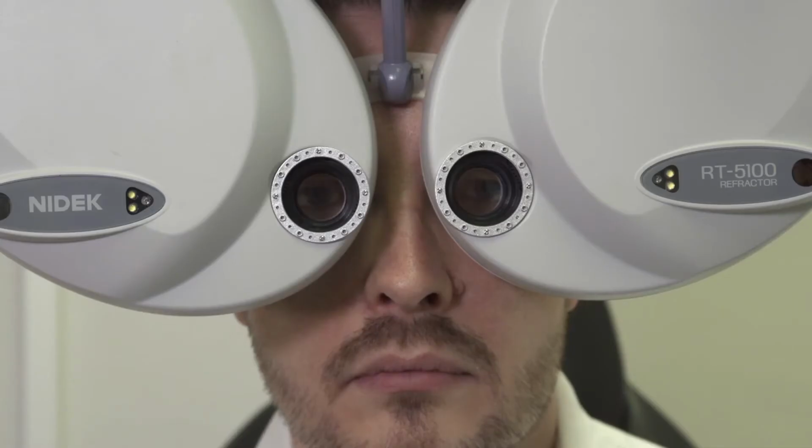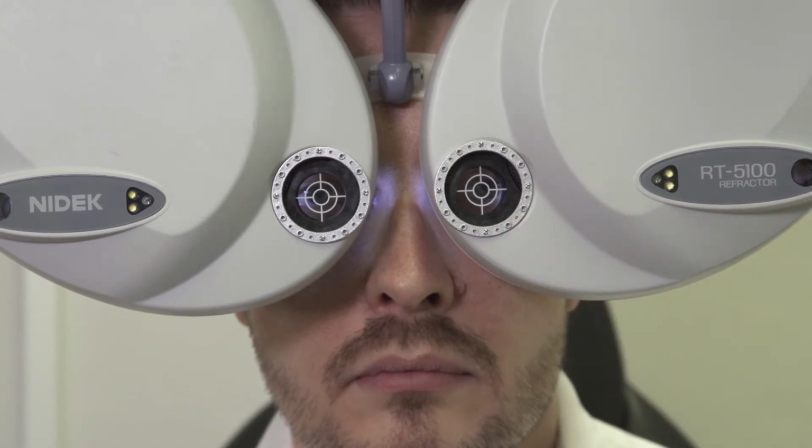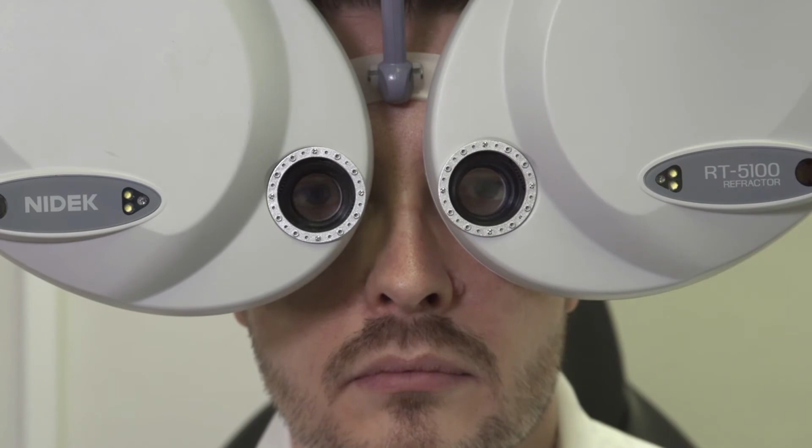We're able to adjust the patient's PD using the PD button on the control panel. By pressing that, we get white graticules here in the centre of the eyepieces that we can manually line up using the dial of the control panel. Once we're happy that the patient's pupils are centred in the eyepieces there and lined up with the graticule, by pressing the PD button, we can start our subjective refraction.